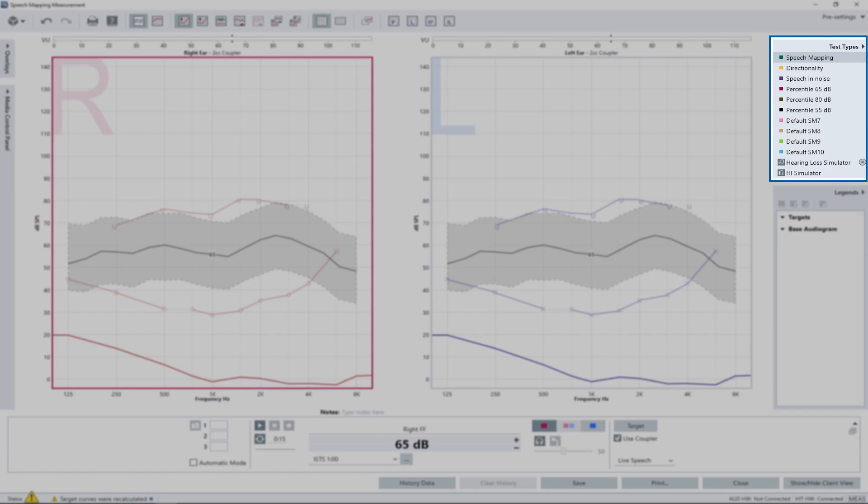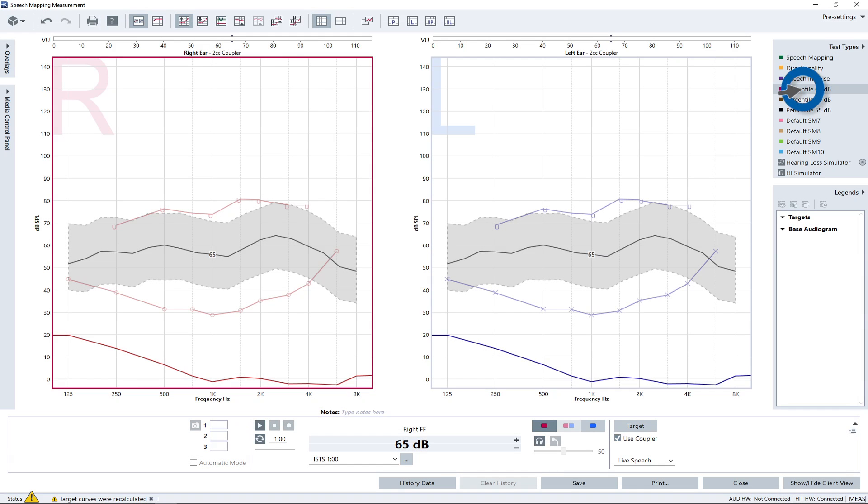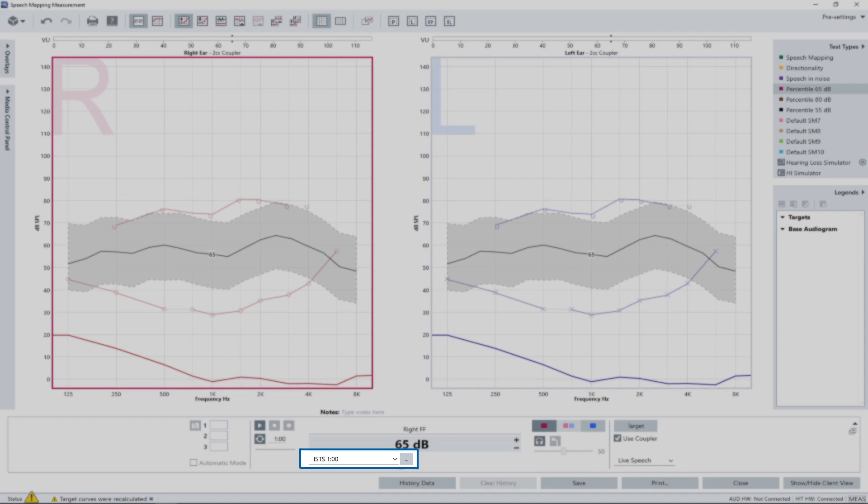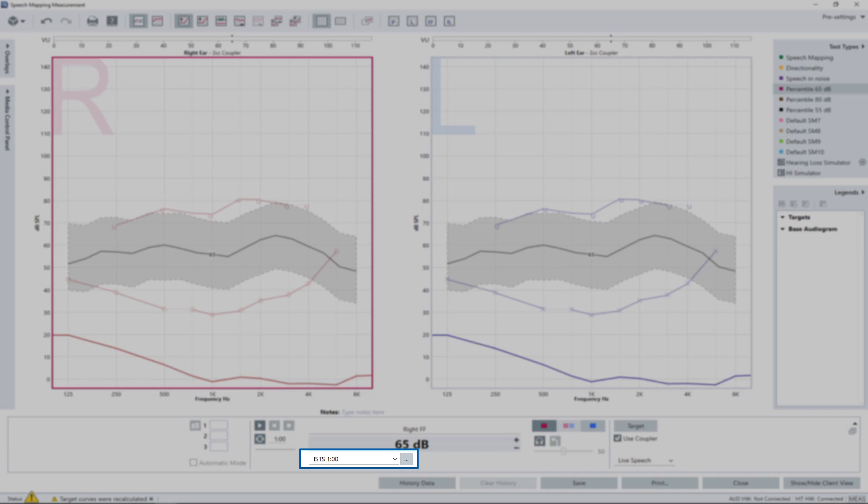In the Unity speech mapping window, select the entry Percentile 65 dB from the test type list on the right. This loads the default settings necessary for the measurement, for example the signal and the level to be used. The default test signal for percentile measurements is the ISTS signal. The signal can be selected from a drop-down box located right below the level control.